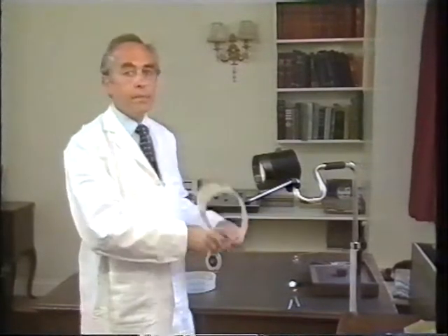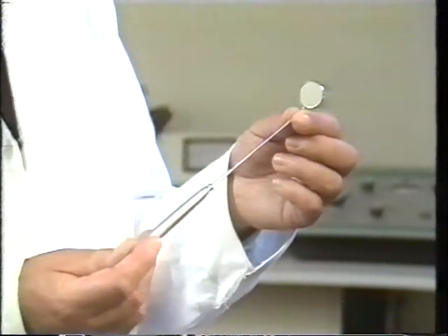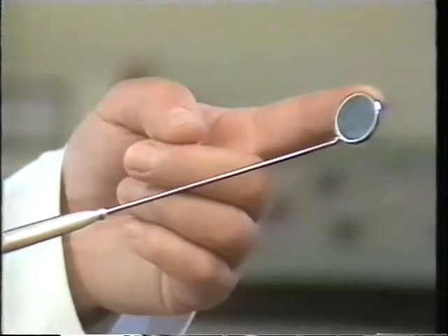With all the inspections in ENT examination, only part of the field can be seen at any one time. Landmarks must be identified and a composite picture built by scanning and mentally superimposing the adjacent small views. Apart from light, special mirrors are needed to reflect the light into anatomical recesses and to provide a line of vision for observation. The instruments required for ENT examination are really quite simple. The techniques for their application are rather more difficult.